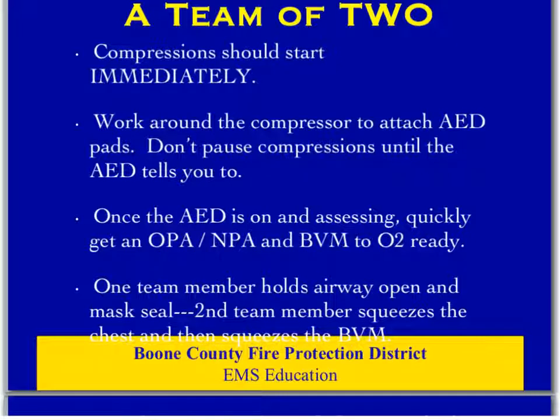Now, if you come in with a team of 2, we should get compressions started right away, immediately, while the second person works around the person doing compressions to attach those AED pads. Open the lid on the AED, let it warm up while you're attaching the pads, and compressions are going on the whole time. We don't pause compressions until the AED tells us to stop compressions and stand clear while it assesses or analyzes. Once that AED is on and assessing, then you've got time to get your orals and nasals and your bag valve mask and your O2 and all that sort of thing ready.